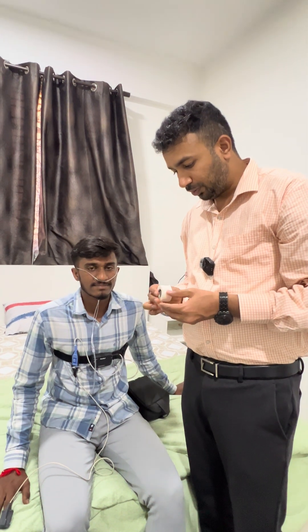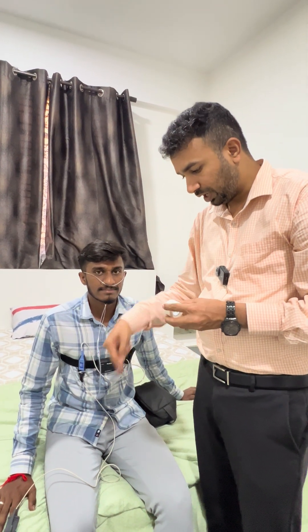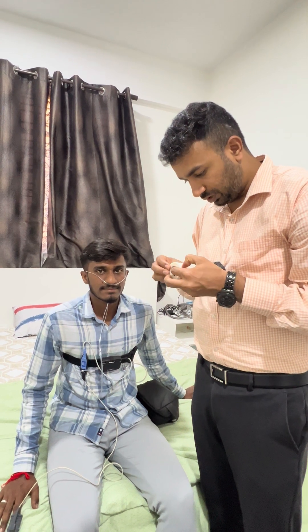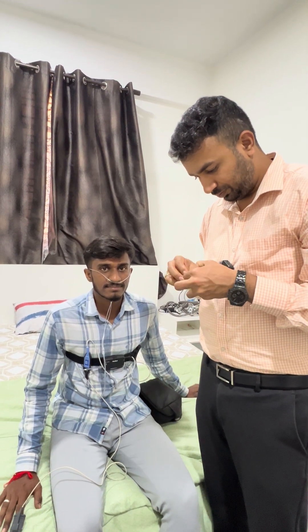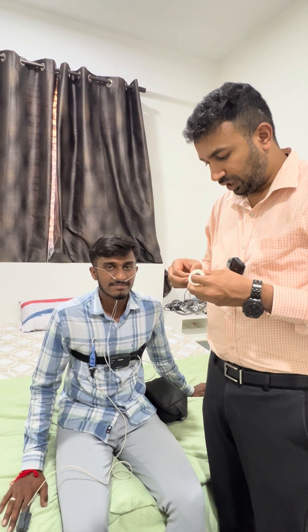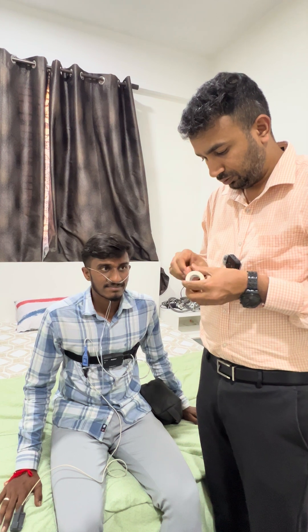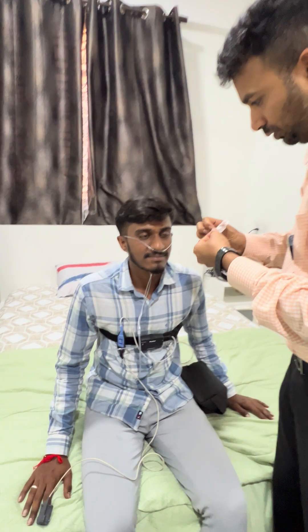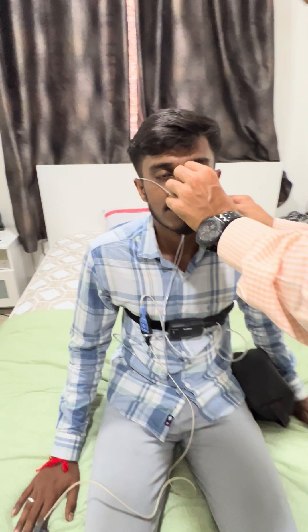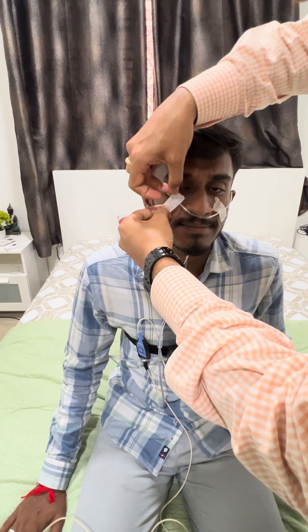If you don't want the cannula or pulse oximeter to come down, you can use micropore tape. Take a small piece of micropore and place it on both cheeks where the cannula tube is connected, so that it is firmly secured and won't fall during the entire night when the patient moves left or right.